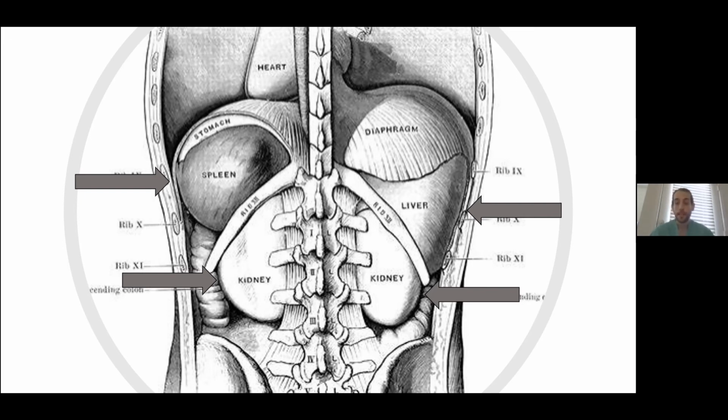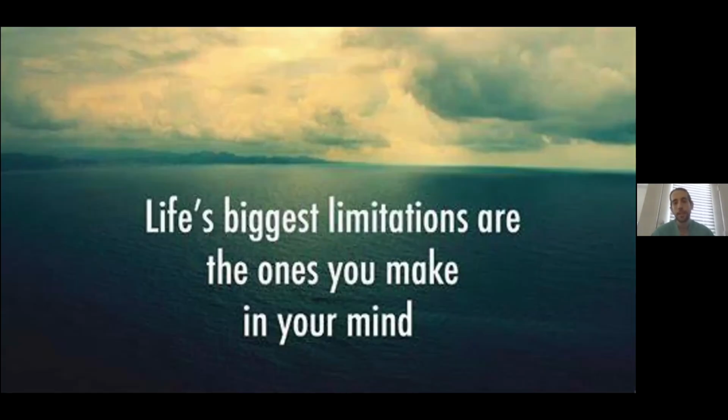So that being said, those are some of the limitations of contrast enhanced ultrasound: you can miss some lesions. So if you have a high suspicion for them, you probably need to do a CAT scan anyway. It's operator dependent and needs some training and experience, just like all ultrasound. Some of us had a learning curve to learn the FAST exam, and so adding this into your arsenal will take a little bit of training and experience.